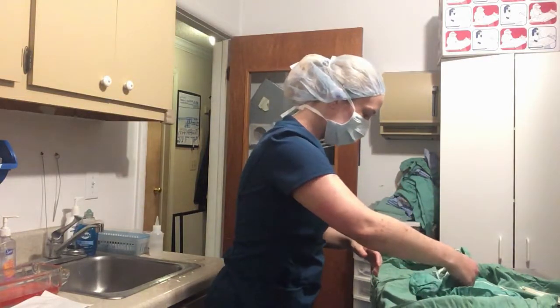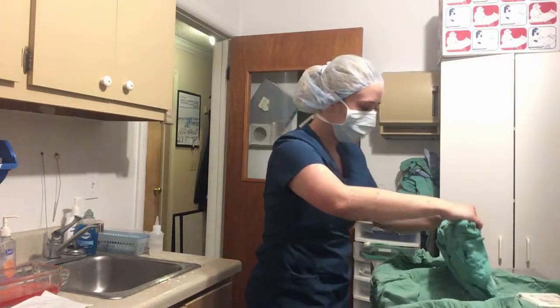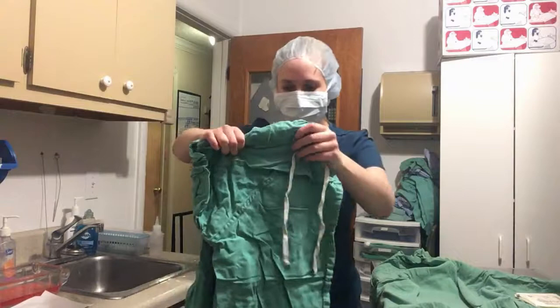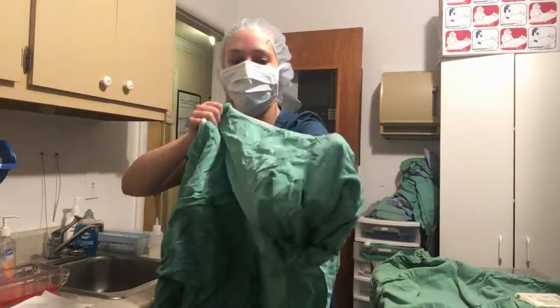So the way the gown should be is with the inside facing me. So I'm going to go ahead and open up the gown, again with the inside facing me.